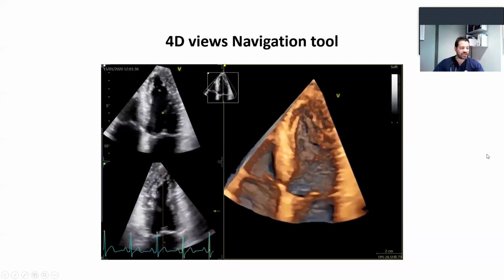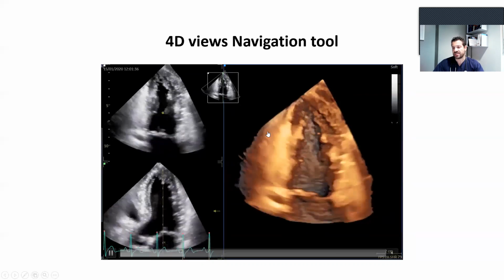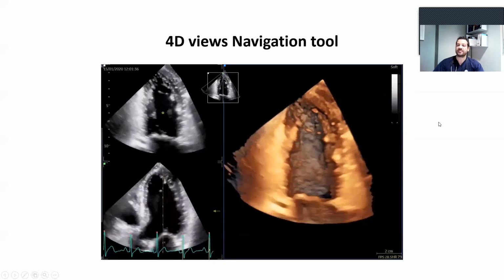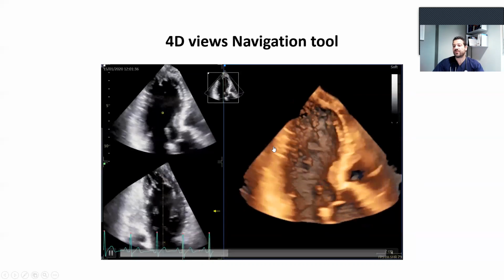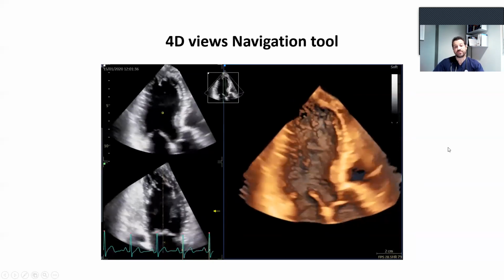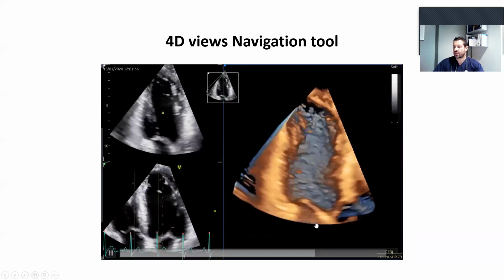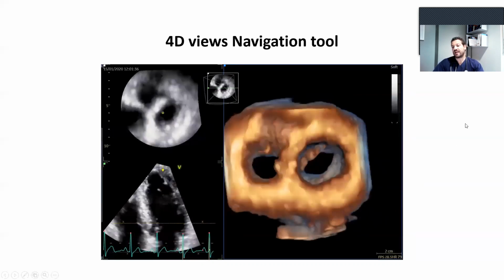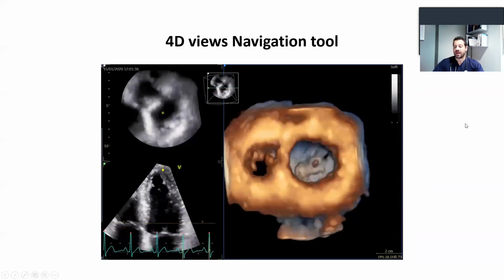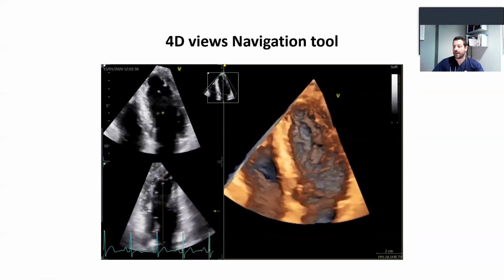There are some semi-automated applications that, after inputting some markers, give us with just the press of one button a 4-chamber, 2-chamber or 3-chamber view. And from transthoracic echo, we can also visualize the septum or the atrioventricular valves of this patient just by pressing one button.